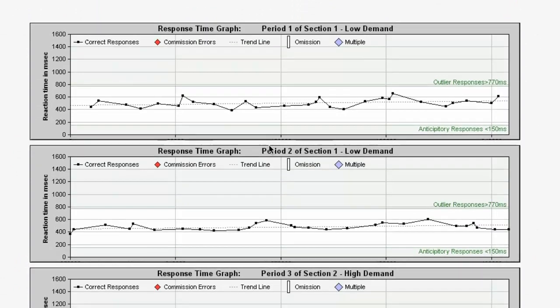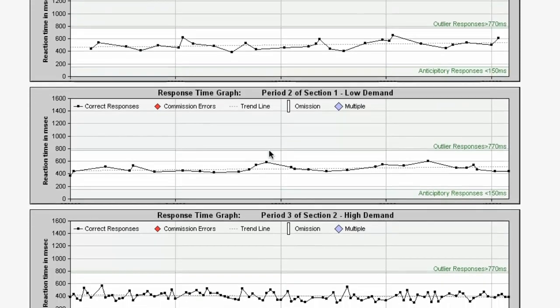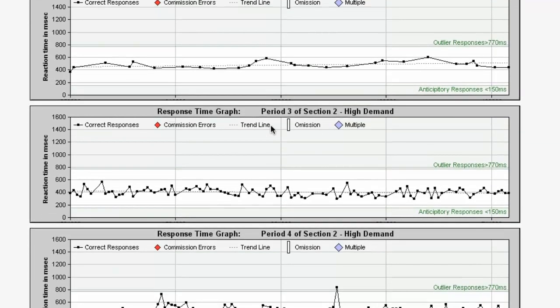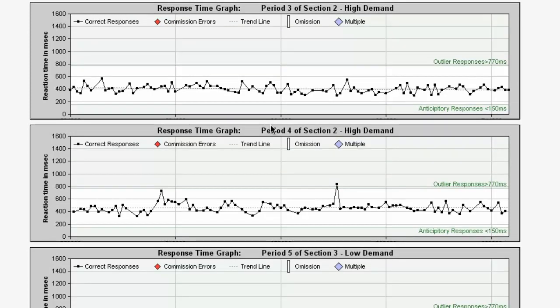This next segment is my favorite, because this actually breaks down every single key press in the test. This is wonderful because you can really see patterns — where somebody slowed down, where they sped up. You can ask questions: I see this place where you really sped up — what was going on there? Or I see a place where you really slowed down — was there a distraction in the room? That can allow for an advanced conversation, like, that was when the dog was barking and I really wasn't even looking at the test. A clinician can really put a judgment on that — very different from, wow, I had no idea I just missed 10 targets in a row and thought I was hitting every single one. That's something we talk about in the assessment practicum weekend.